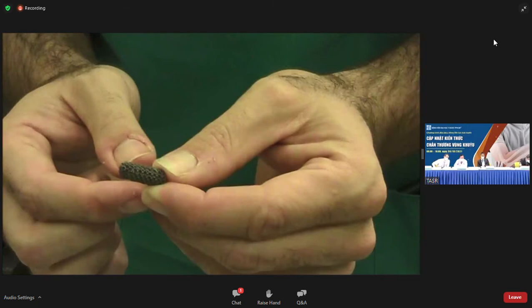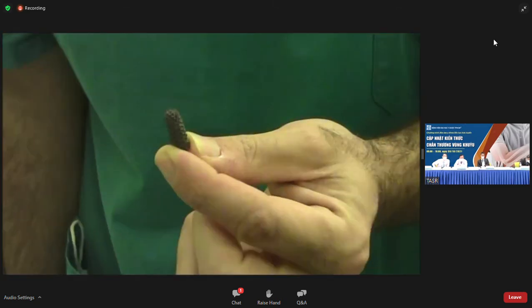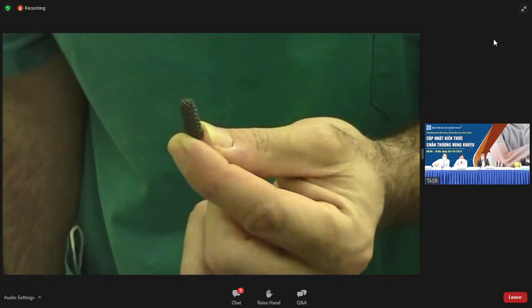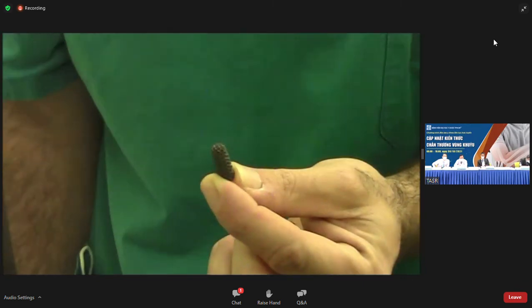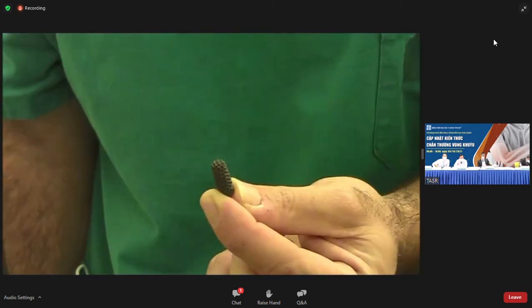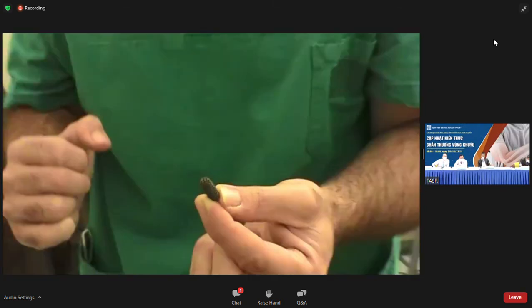The bone likes a lot all this expansion that you can see here. And by definition, when you measure and pass from the trial to the definite prosthesis, you will find that there is a very nice fit you will feel in your hands.